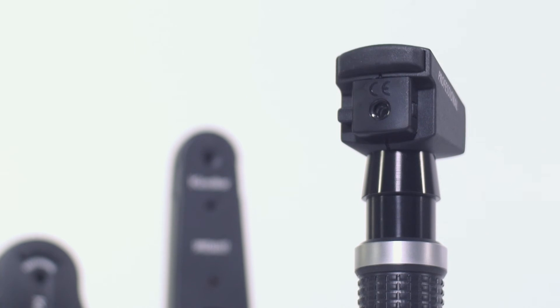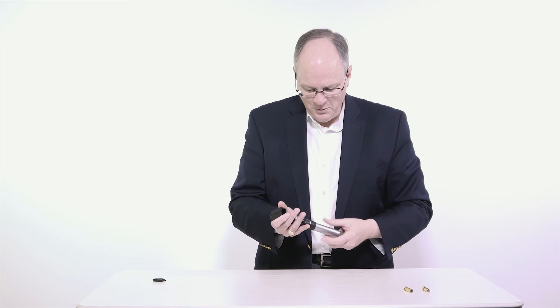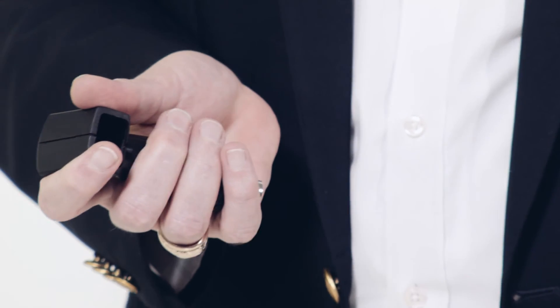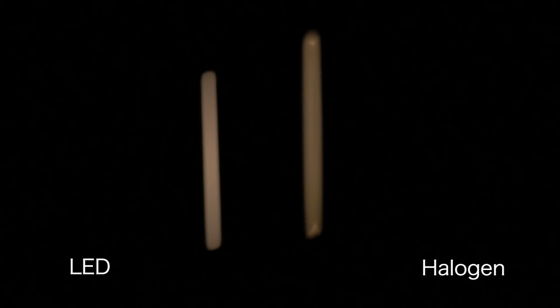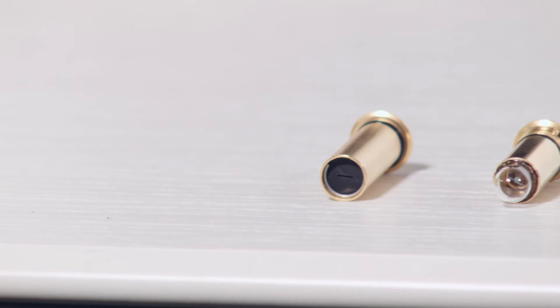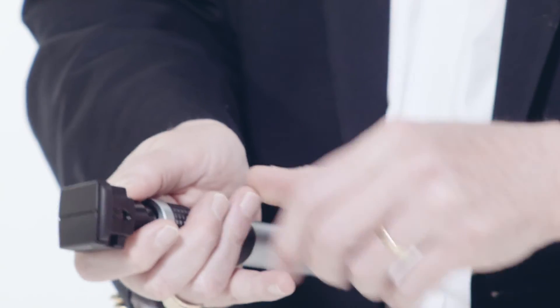Moving on to the handheld retinoscope. The Keillor retinoscope is a true bimodal instrument optimized for outstanding performance with either a streak or spot mode. The exclusive streak LED BCS technology offers increased brightness, contrast, and sharpness, and the LED technology provides increased battery life and reduction of replacement bulbs. Focus the retinoscope by sliding the focus control up and down. The middle position is used to determine the presence and axis of any astigmatism. The Keillor retinoscope comes with a brow rest to accommodate spectacle wearers.